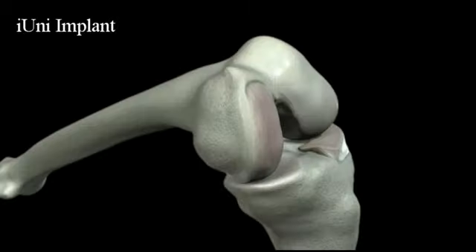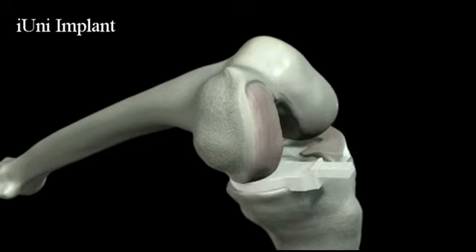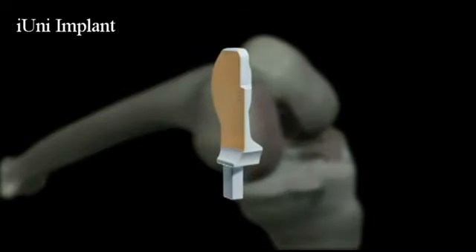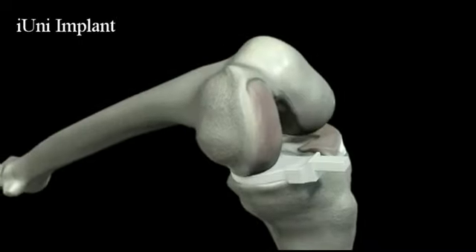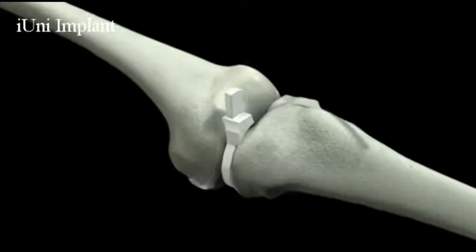Step 2. Balancing the knee. Select an appropriate balancer chip from 4 available sizes to achieve the desired ligament tensioning. Next, insert the selected balancer chip in flexion between the femur and tibia with the flat surface facing up. Then bring the knee into 0 to 15 degrees of flexion and confirm the desired tensioning.